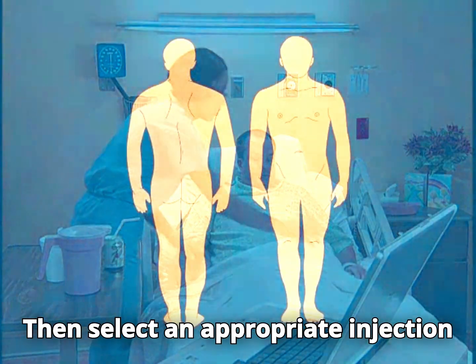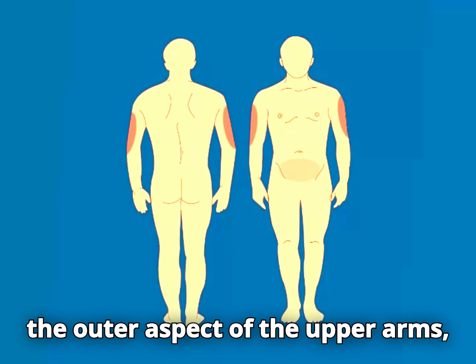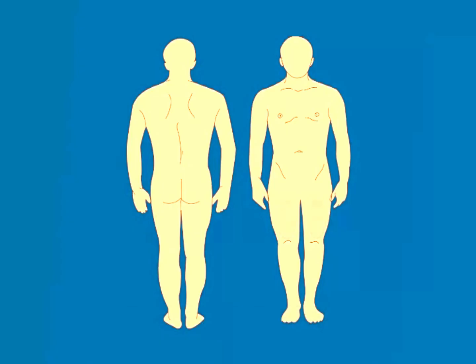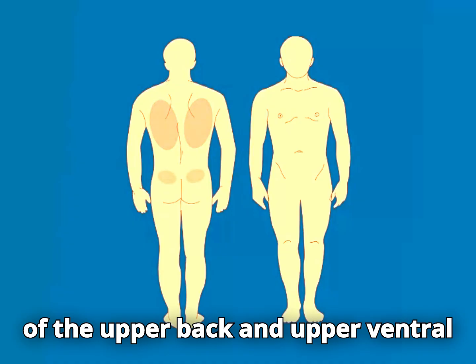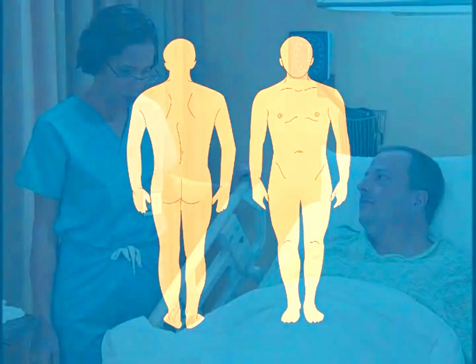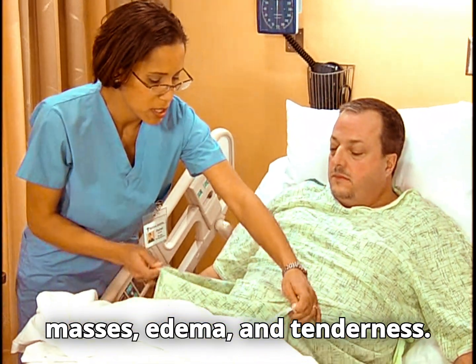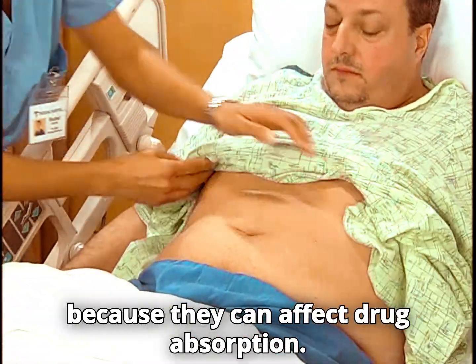Then select an appropriate injection site. The best choices are the outer aspect of the upper arms, abdomen one to two inches from the umbilicus, and anterior and lateral aspects of the thighs. Other options include the scapular areas of the upper back, and upper ventral or dorsal gluteal areas. Inspect the site for bruises or inflammation, and palpate it for masses, edema, and tenderness. Avoid sites with these abnormalities because they can affect drug absorption.